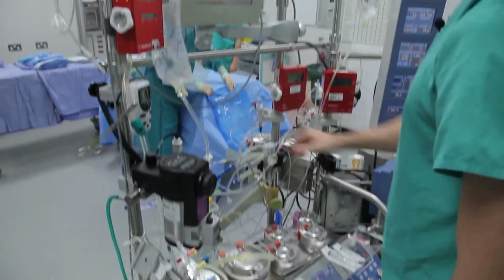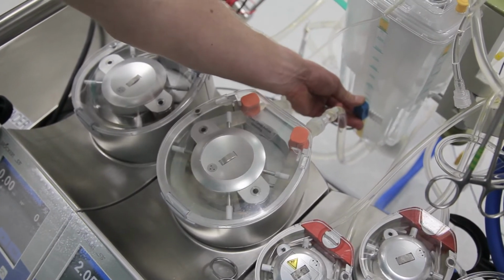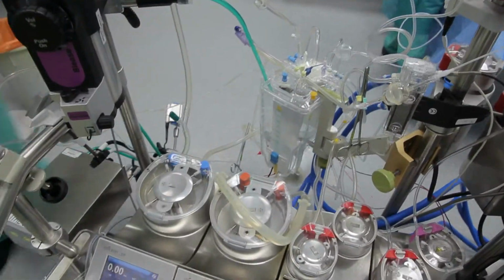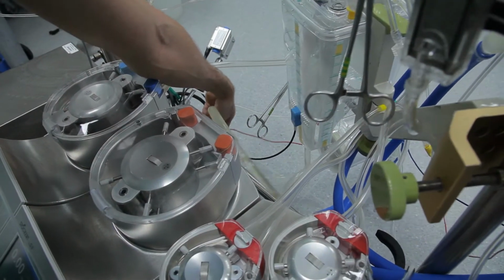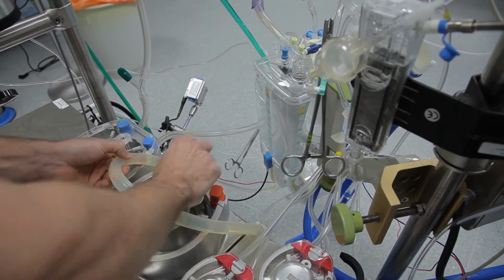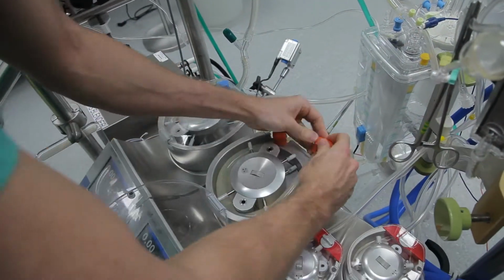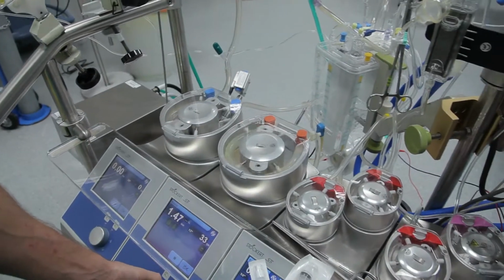So that's running, and now we turn the level sensor on since it's past the level sensor. Then we just check that the level sensor is working by lifting it off the pump, and the pump should stop like that. We gravity prime, so I'll just do that now. Put the pump boot into the pump head. Set that going at 2 litres a minute.